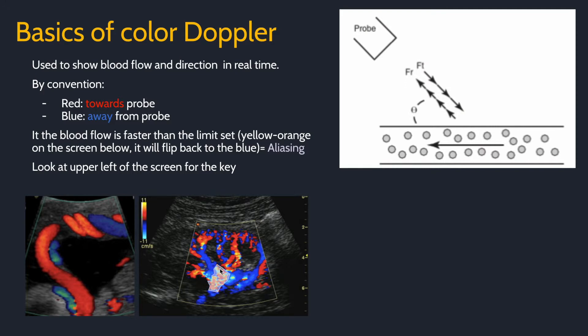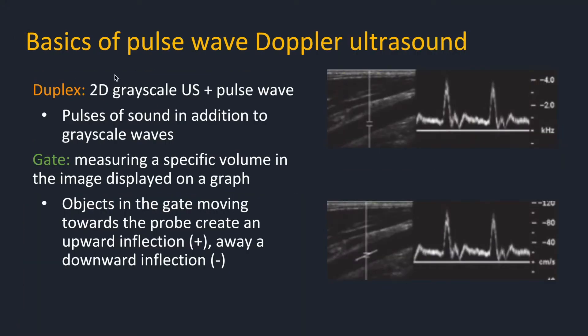This is an example of aliasing in the main renal artery. Pulse wave Doppler is similar to color Doppler, but instead of looking at an area as a whole, it investigates a specific volume between the gate. Rather than show direction as color, it will show direction on the graph. This allows for more sophisticated analysis such as peak velocity, ratio of diastolic and systolic flow, and more.